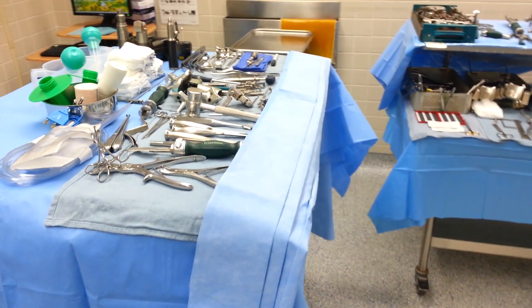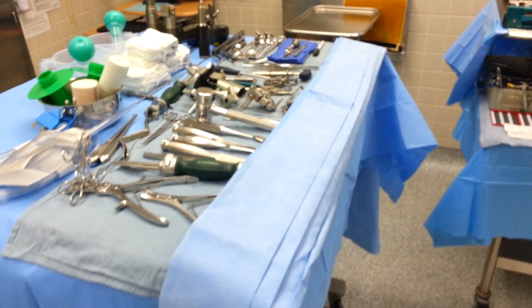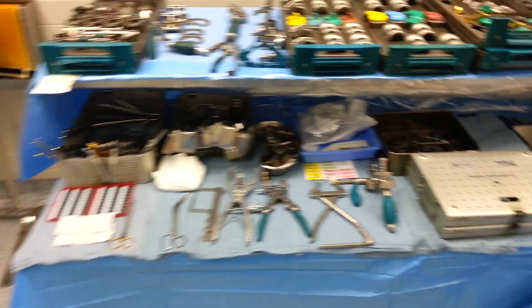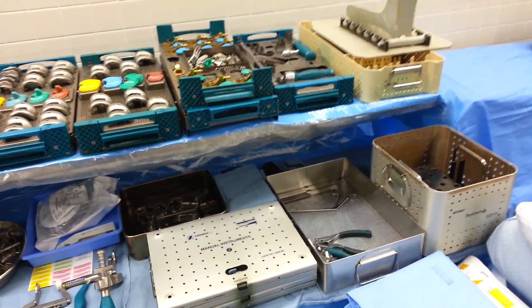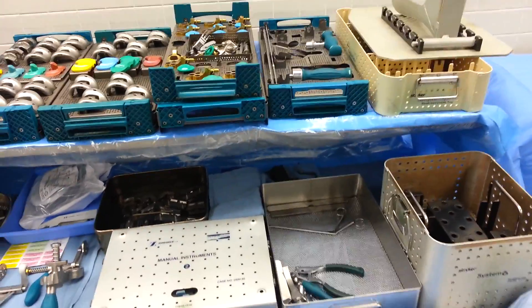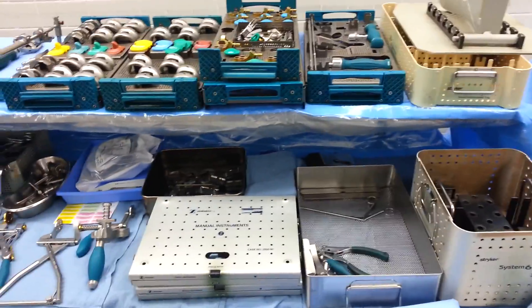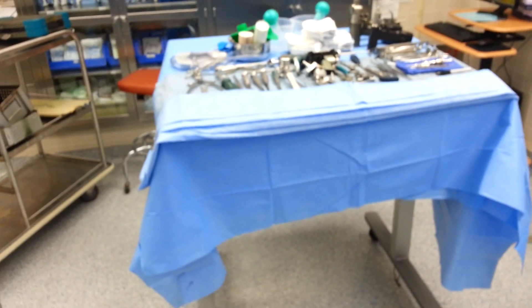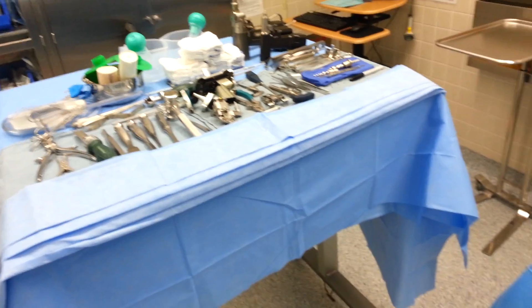Hello, we're going to do a little video explaining Stryker Triathlon total joint setup for a knee. My name is Ken, I'm a scrub tech here at Lakeland Hospital and this is my setup. It's also the same setup the other two ortho scrubs use. This is just what we've come up with as our best practice for having everything available and being as efficient as we can.